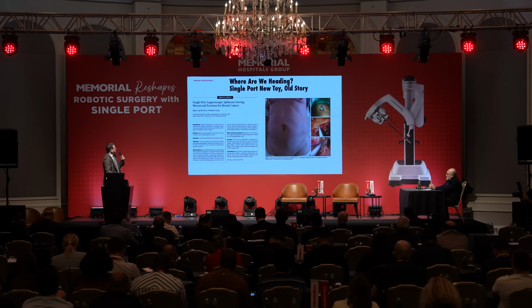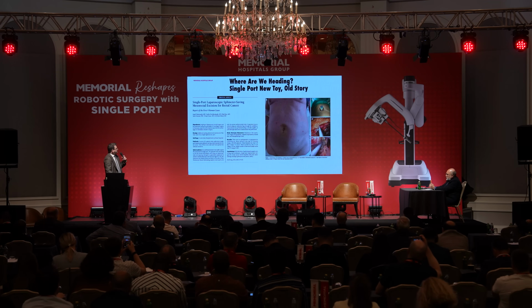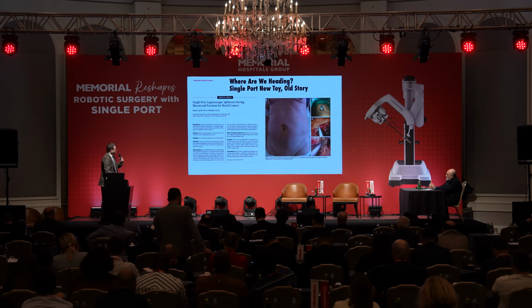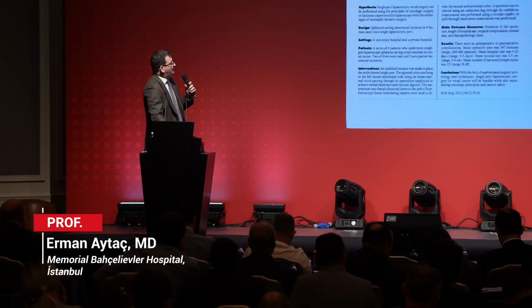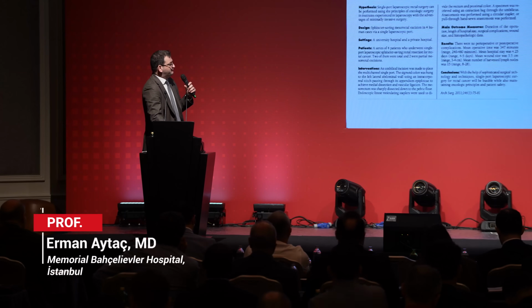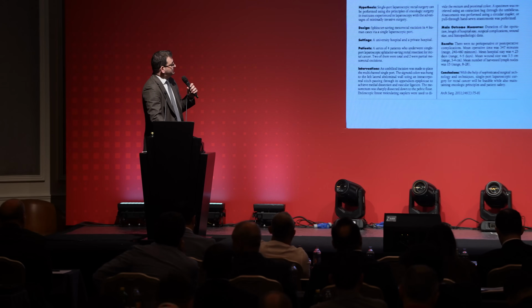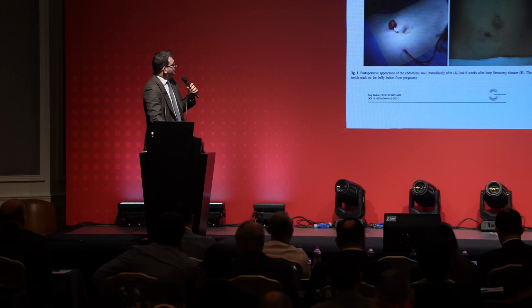This is an image that we did 15 years ago with my mentors. We are the ones who did the very first laparoscopic single port total mesorectal excision in 4 patients. And we didn't do it again because of the struggle with the instruments. We waited until we had the proper time to start this program again because of the lack of triangulation, vision, and other implications of the technology.